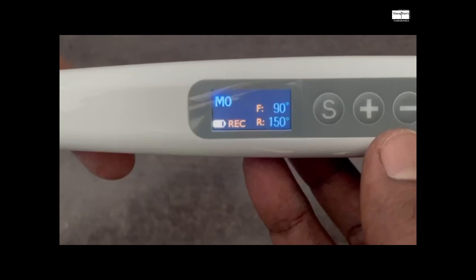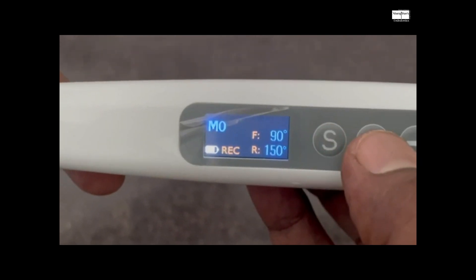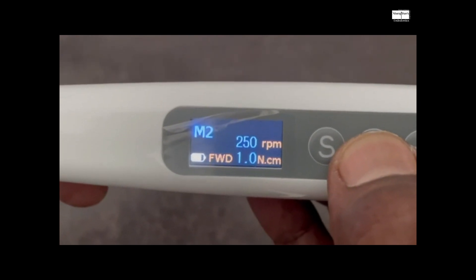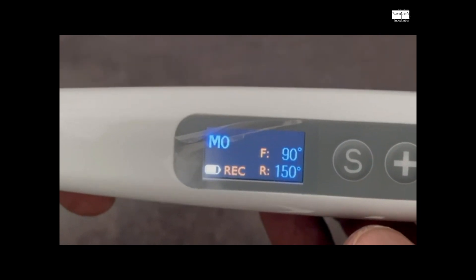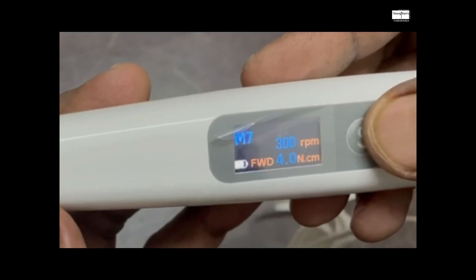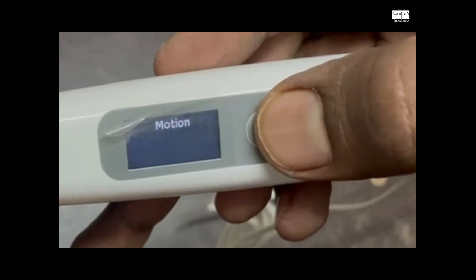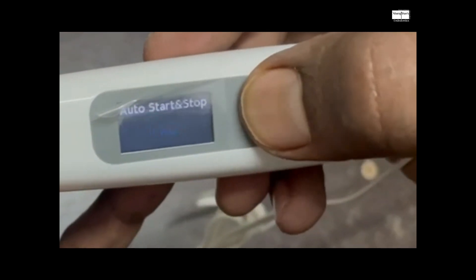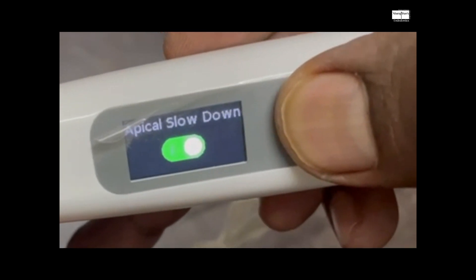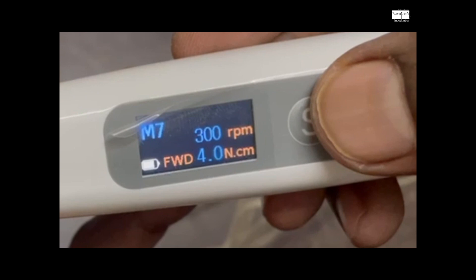Program number 0 is the reciprocation mode — an open reciprocation mode where you can change the forward and reverse reciprocating angles according to the file system you're using, like Reciproc or WaveOne, or any other custom reciprocation angle. There are 10 different programs and one dedicated Apex Locator program. You can adjust speed and torque, and there are AI programs like automatic start and stop — the file starts revolving when it touches the tooth and stops when you remove it. There is also automatic slowdown when you reach the apical third.